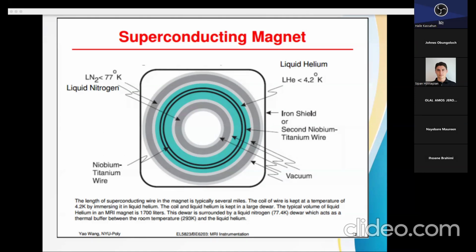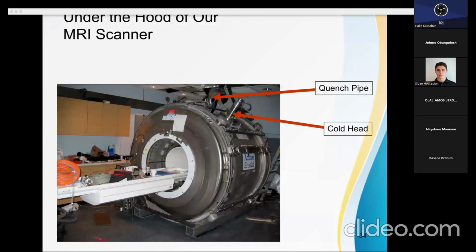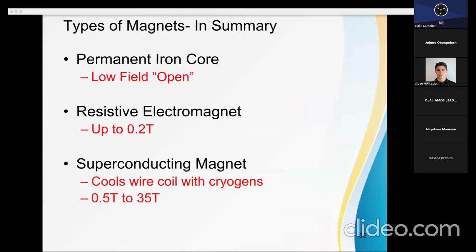However, if you have the means to do that, it's an excellent system that everybody would wish to have. Unfortunately, it has its own challenges that prevent many people from accessing such a system. And as you can see, such systems are normally huge in size and in weight to provide the vacuum and space for the cooling cryogens into the system.